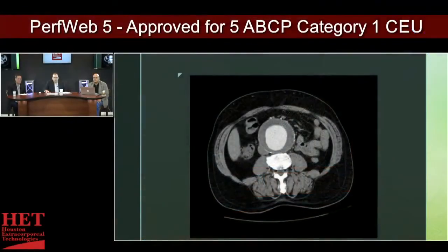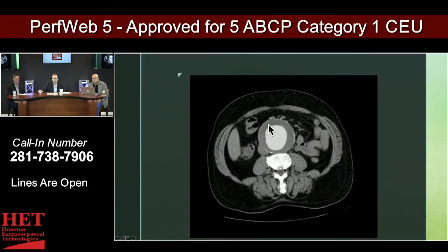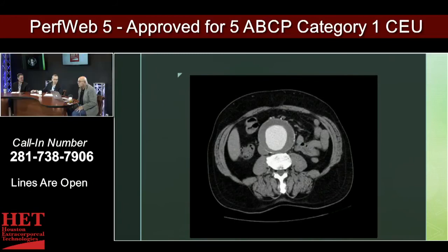This is an infrarenal aortic aneurysm, well within the belly. Just below the renal artery — these are your psoas muscles left and right, this is the spine, just some of the viscera, rectus muscles left and right. This is the aorta just above the bifurcation into the iliacs, and this is the aneurysmal portion. Oftentimes it will be thrombosed, having clot or atheromatous debris, and then centrally you'll have the contrast.